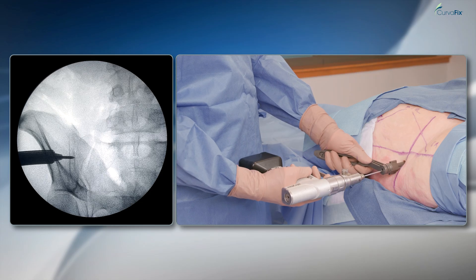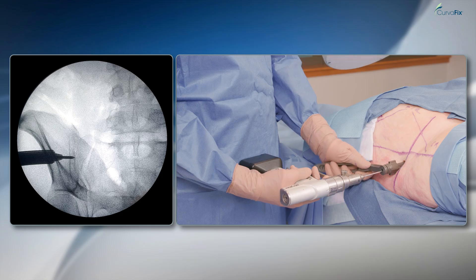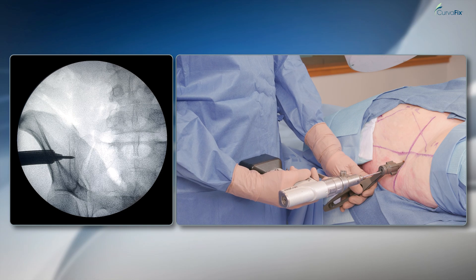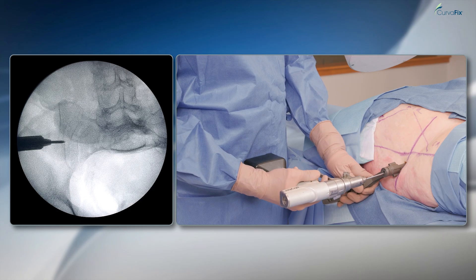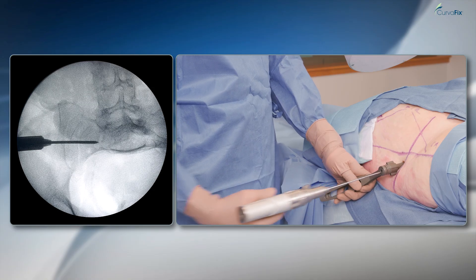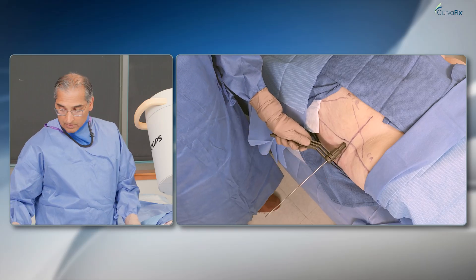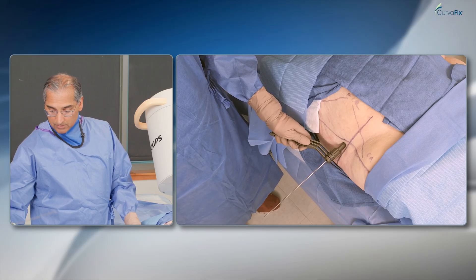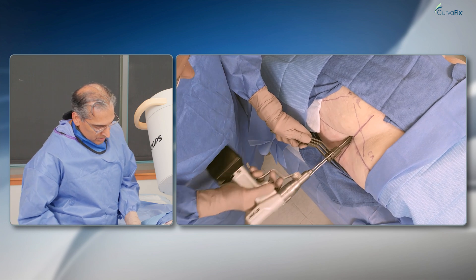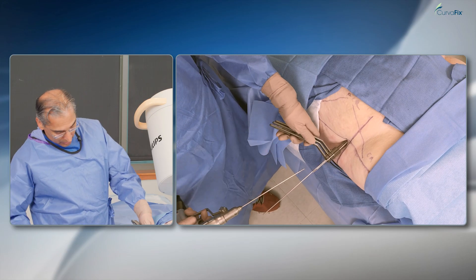Making sure I'm not going somewhere I shouldn't be on the outlet view — that'll work. I'll take the pins so I can pin this in place. One of the features of the new system is the Trocar that can be pinned into the bone, so you can be hands-free once you find your starting point.